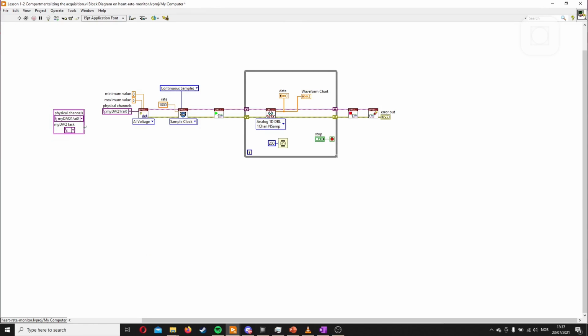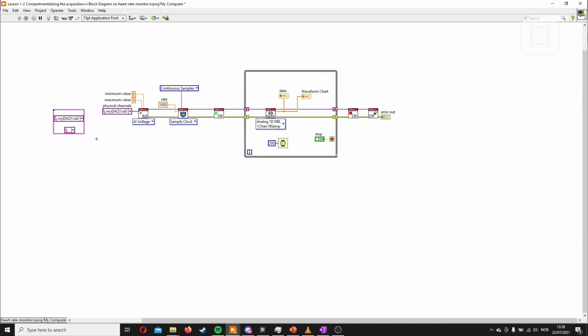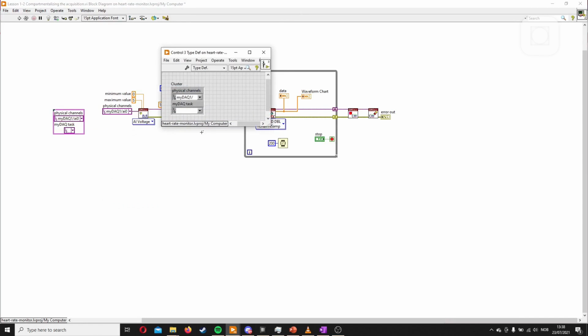And now we'll create a type def. A type def just makes this a global data type. So if any place uses this type def and we add or remove some data point from it, like we add a new task or whatever, it will update everywhere. So make a type def. When we make a type def, the name always disappears, but we'll add it again. Then we just right click here, open type def, and here we can see it.